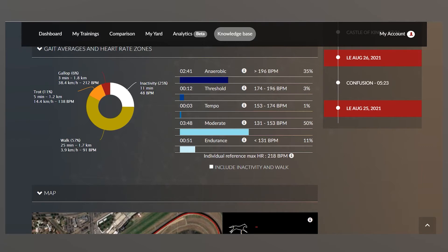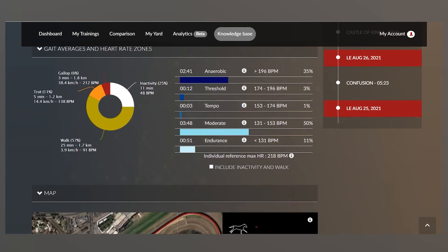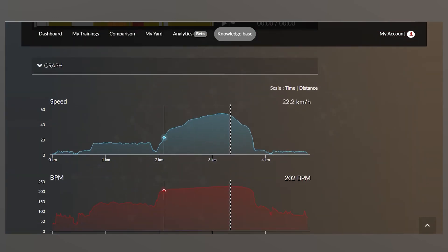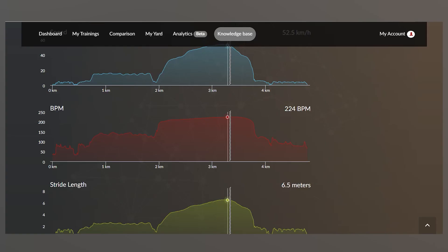Scrolling down, it will calculate the profile of the intensity of the work — here he spent two minutes 41 in his anaerobic zone, up at his maximum heart rate, which means he's had a decent gallop with a bit of effort. We can look at his speed throughout the gallop and also his heart rate: he went out for a trot to warm up, went into his gallop with a very steady heart rate building as he approached the finish line at 224 beats per minute, then coming back down as he slows down and goes into his recovery walk.